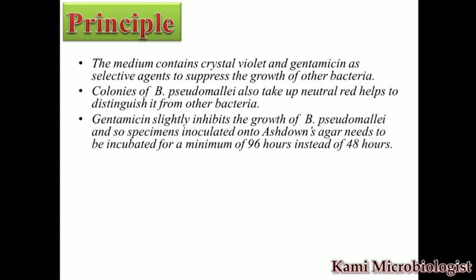Then we have gentamicin. Gentamicin is a special type of antibiotic that can inhibit the growth of other bacteria, and in this way Burkholderia pseudomallei and other Burkholderia species can easily grow.